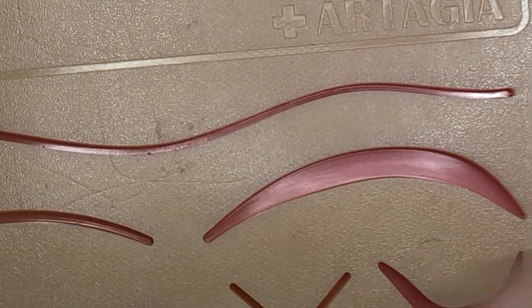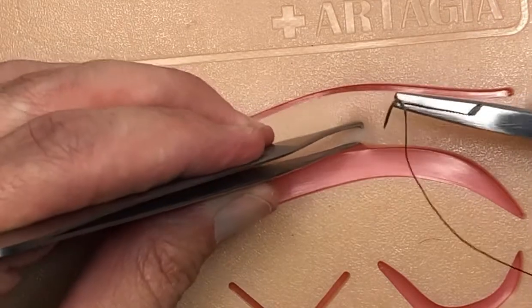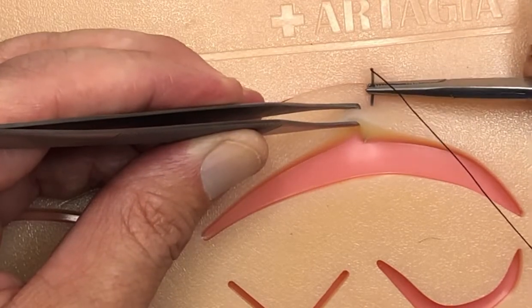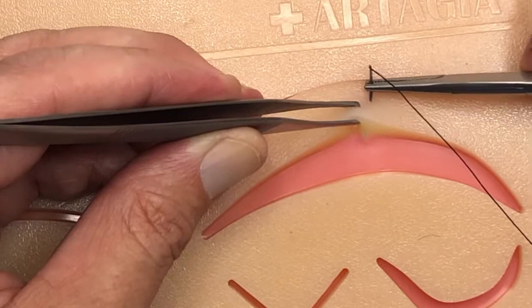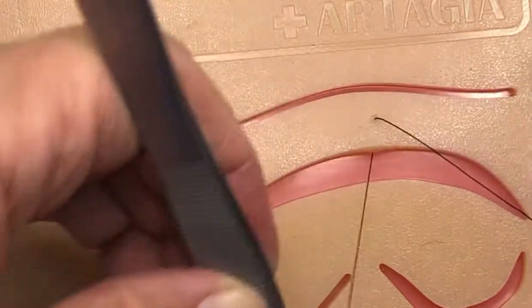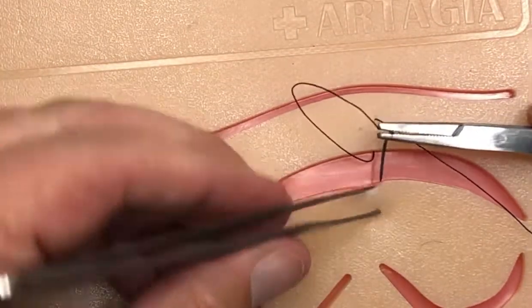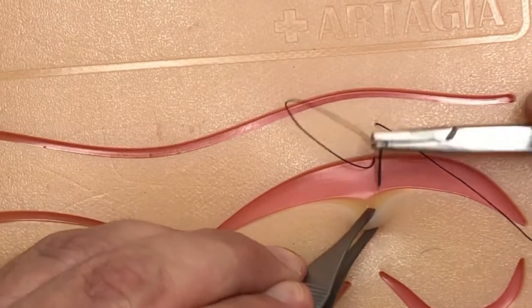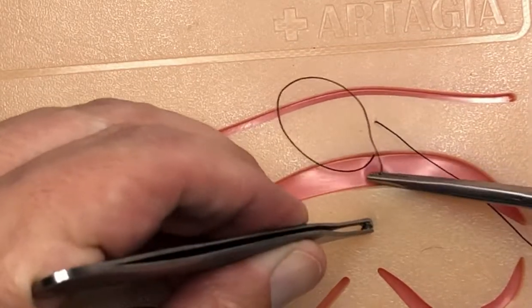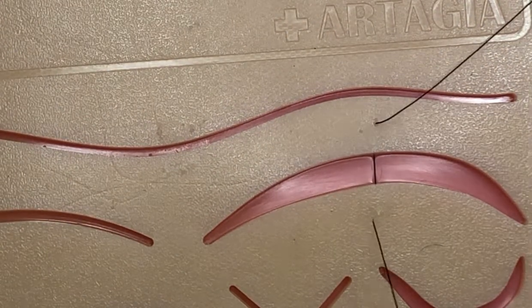This is definitely one where you want to utilize your non-dominant hand with the tissue forceps. I'm going to go far and deep, and then come out right at the base — so this would be like a very deep dermal suture. I'm going to use my tissue forceps to expose the wound and the tissue, get down nice and deep right there, and then come out. We've got the far-far aspect done.